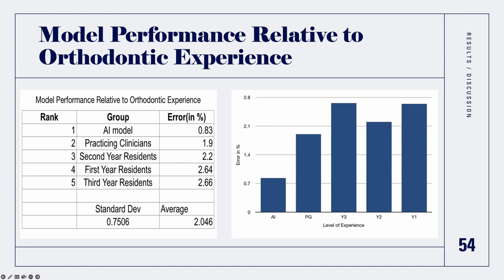Lateral cephalograms are useful diagnostic aids, but as we said, most clinicians do not have the time to trace them and simply use them to visually guess relations between structures, which leads to their underutilization. Utilizing a model whose accuracy appears to outperform that of the average clinician would allow practitioners to identify key landmarks and their relations in seconds rather than minutes and better guide treatment decisions.